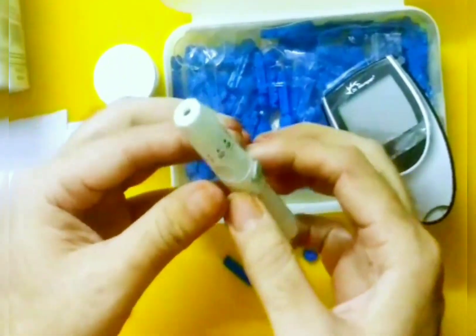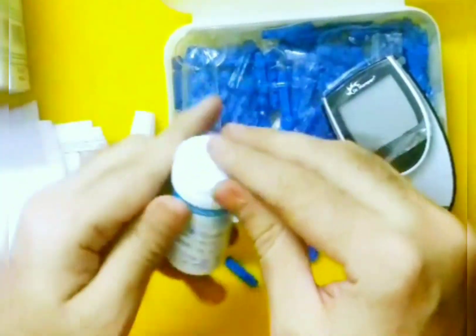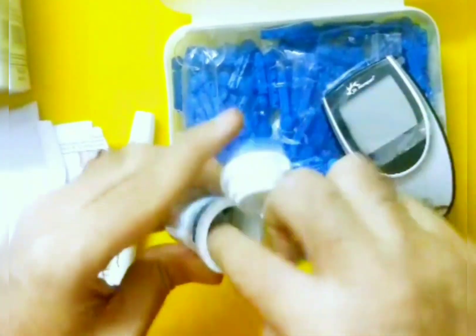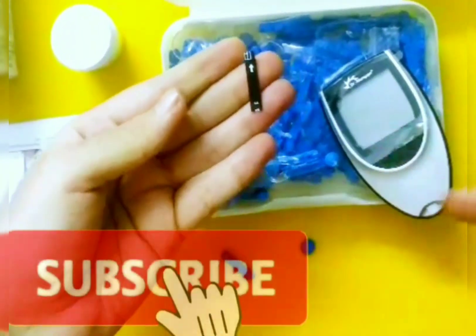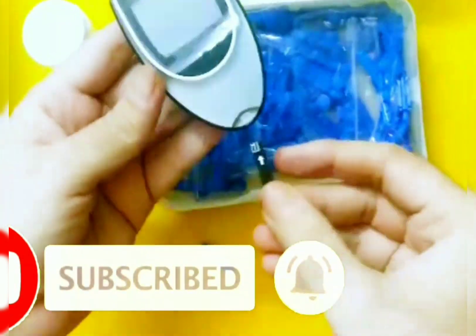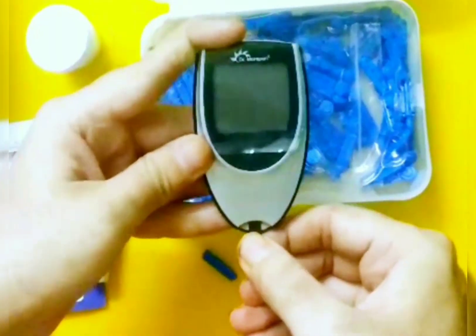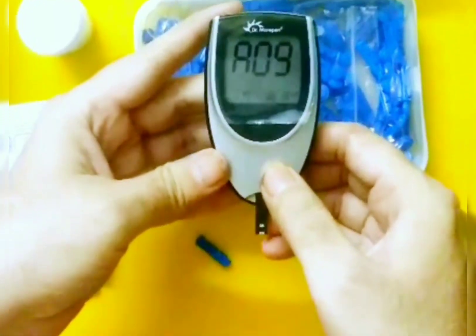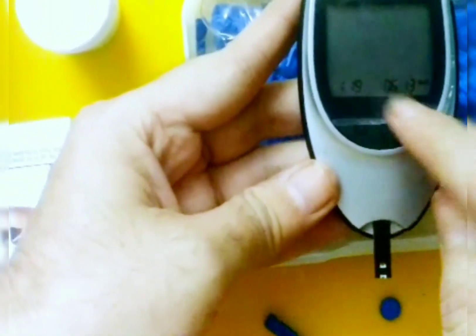I will take out a test strip. This is one of the test strips — it has an arrow, and this arrow should go inside the meter. As soon as I put the test strip, it will switch on automatically. See, it is on now.